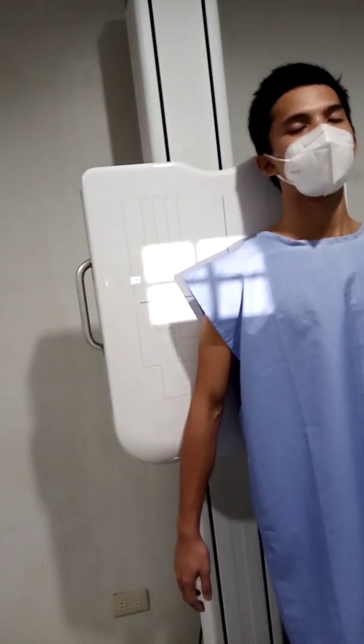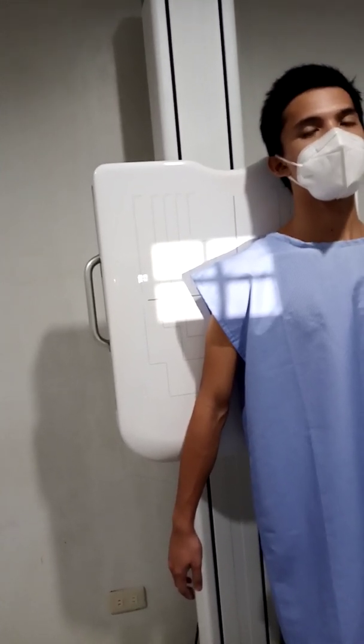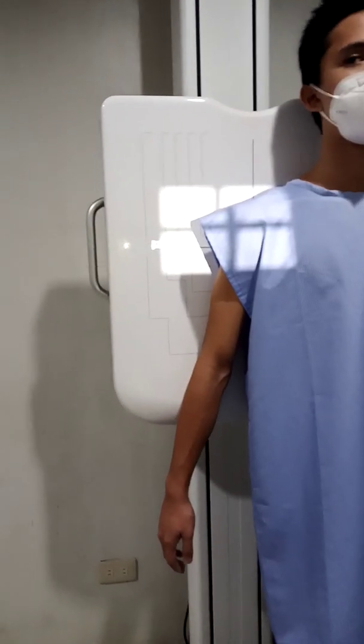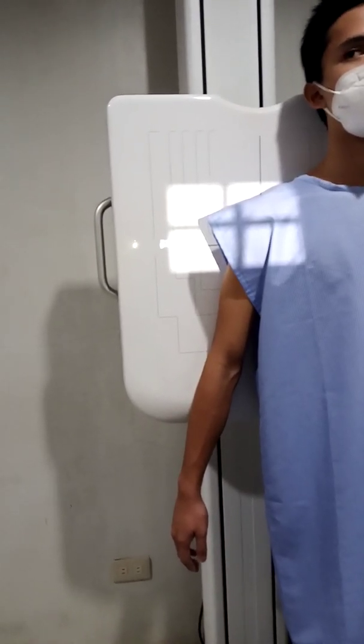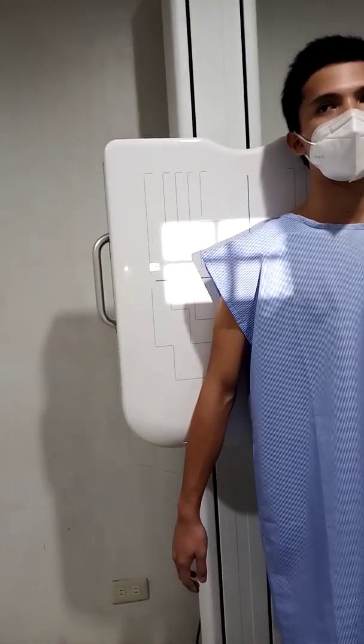The next position is adjust the position of the IR so that the center is 1 inch or 2.5 centimeter inferior to the coracoid process. So this is your coracoid process.